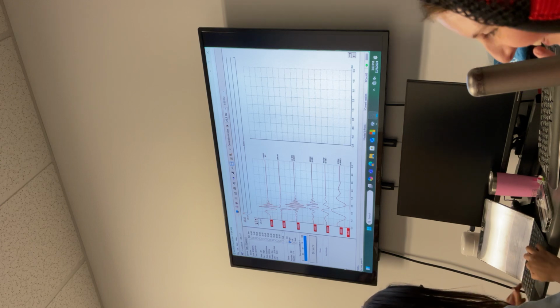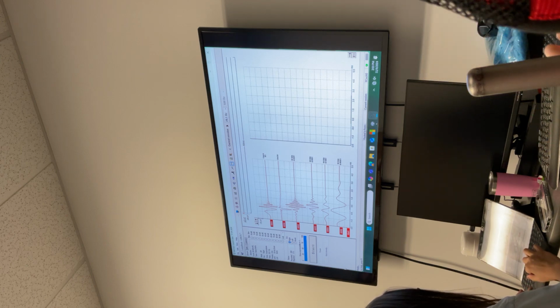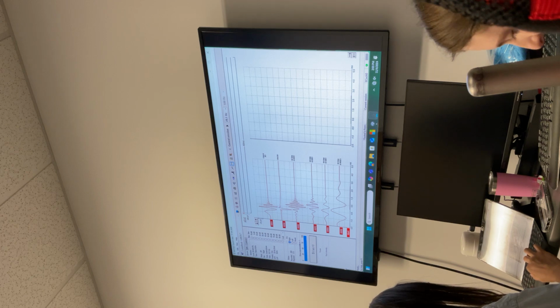So what notes are you writing? CE chirp, click. I'm texting myself to remind myself. Okay. So it's CE chirp, then click, narrowband 4215. Perfect. Okay, I passed the class then. I'm ready to move on.